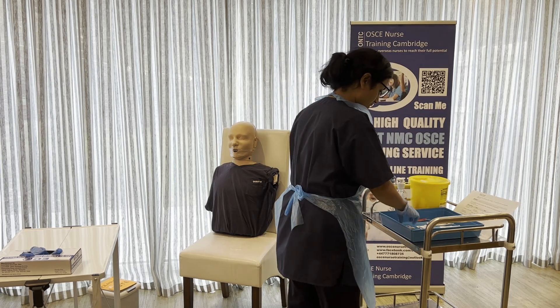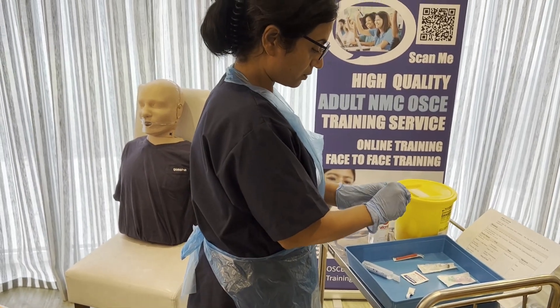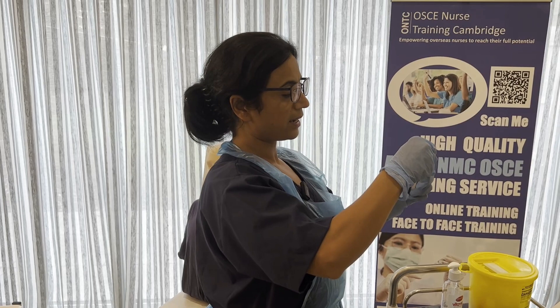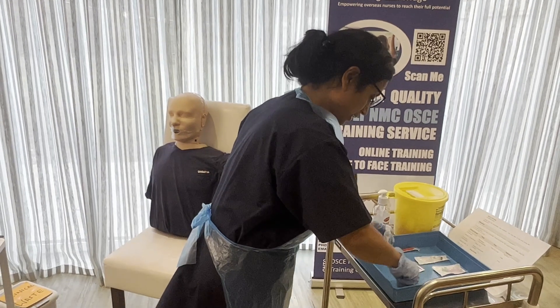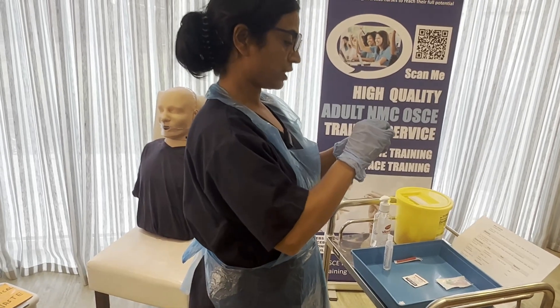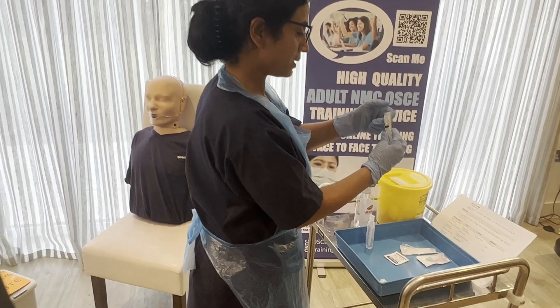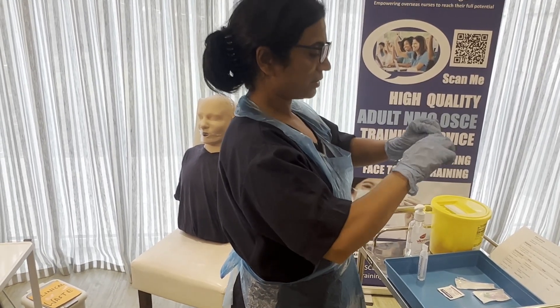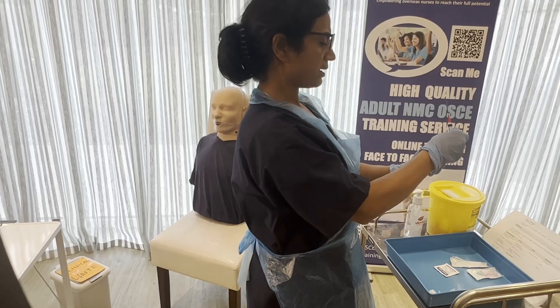The drug is already checked. The first thing is to clean the vial of medication. We'll clean it for 30 seconds with one motion, then let it dry for 30 seconds. While that is drying, I'll open my syringe without touching the key parts — the front of the syringe — and then open my drawing-up needle using aseptic non-touch technique, and connect the two.